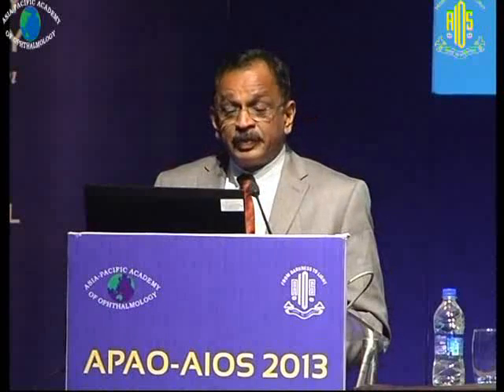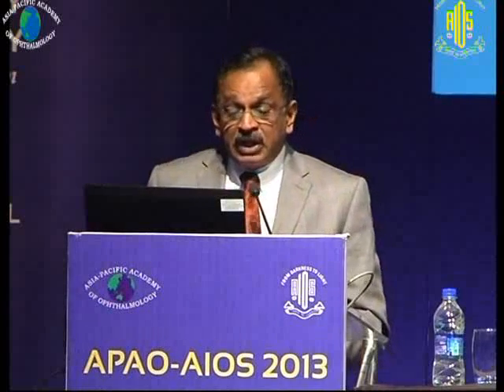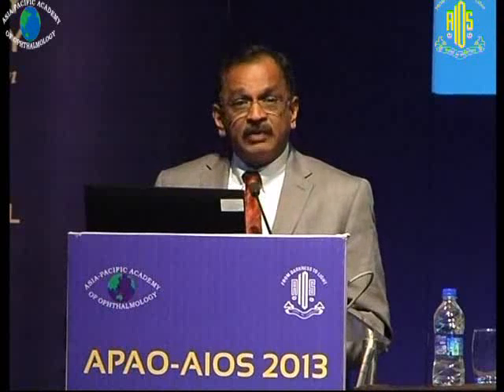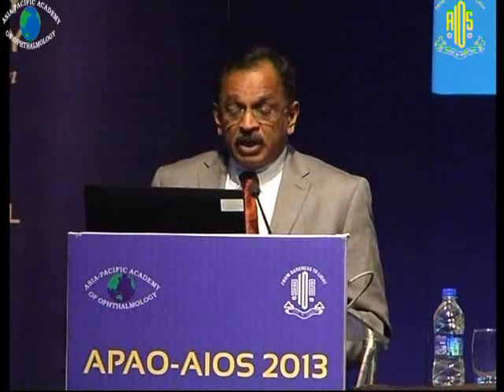And focal retinotomies can be done when there are star folds which are not possible to remove. Again, to do a retinotomy or retinectomy, earlier we were very often using the scissors. Today with the vitreous probes you could do it much more comfortably.